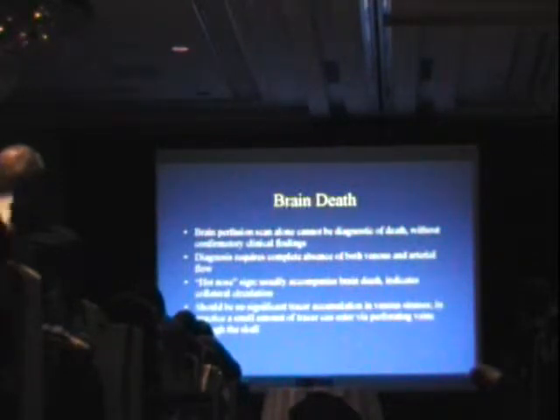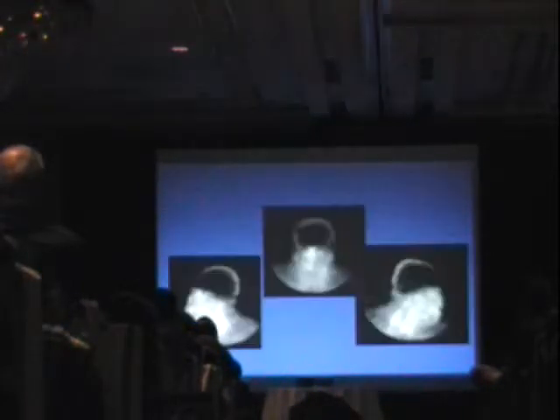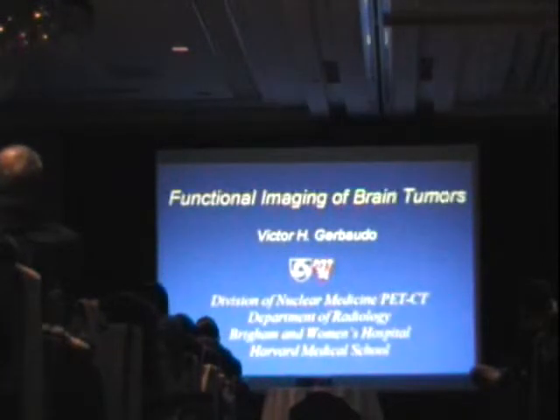Hot nose sign, you often will see that. It's not necessary to see it. It reflects increased blood flow, because the blood coming up through the internal carotid needs some way to egress, and so it collateralizes to that part of the head. So this is a brain death study. You can see that there's just nothing in the posterior fossa, nothing in the cerebrum.